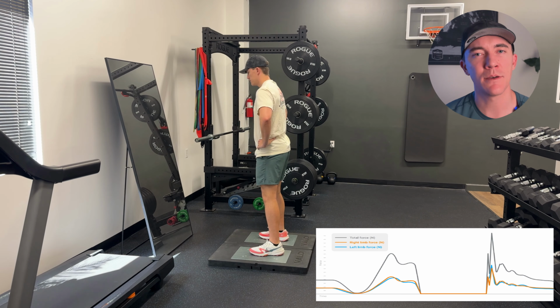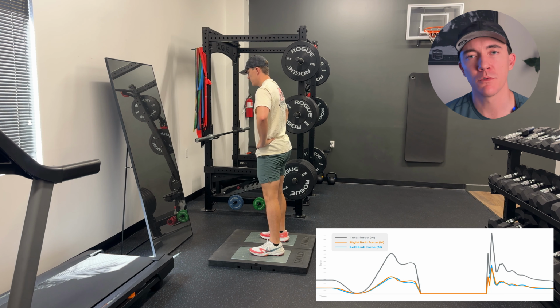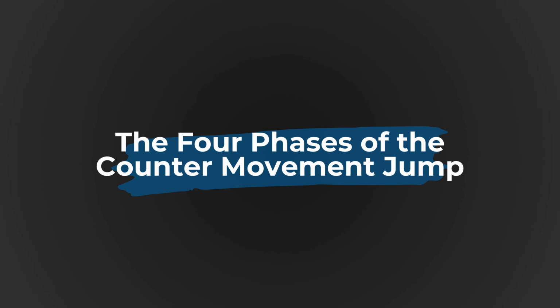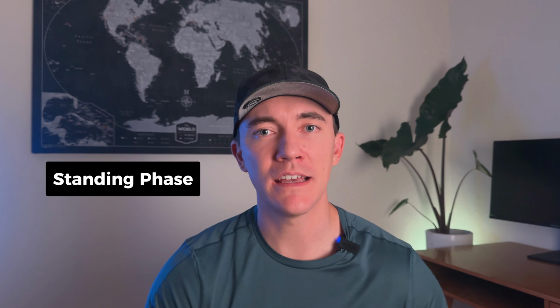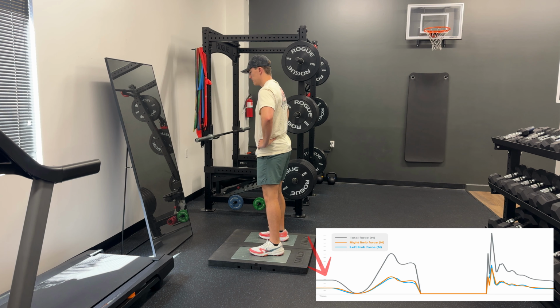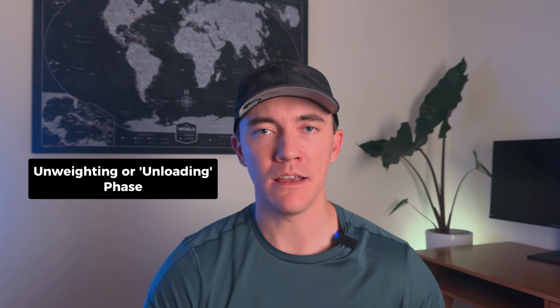This is an example of a force time curve representing a counter movement jump, which is one of the most common jumps you'll use with the force plates. The first phase is simply the standing phase. You can see here, the line is completely flat. The individual standing on the force plates is just standing there and not moving, so there shouldn't be any fluctuations in the forces being put into the plates, which is why the line is flat. The second phase is the unweighting phase.